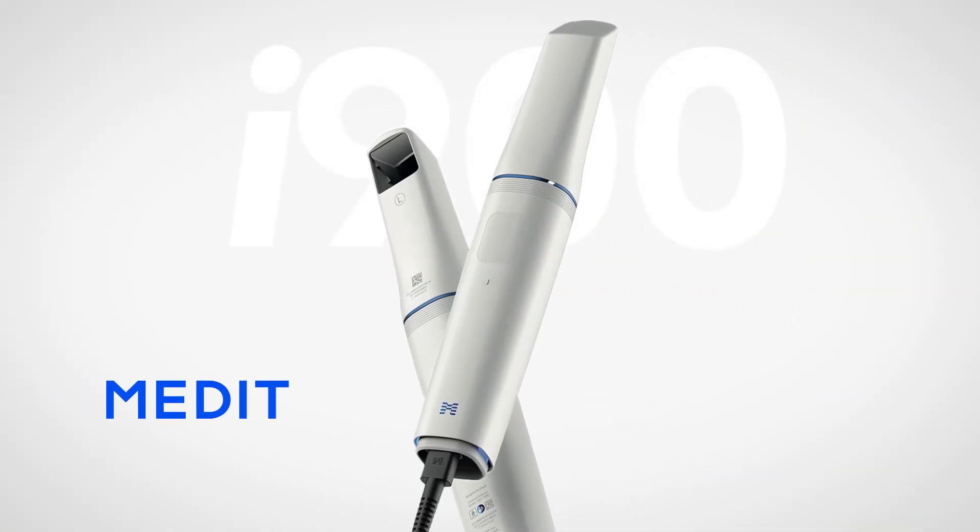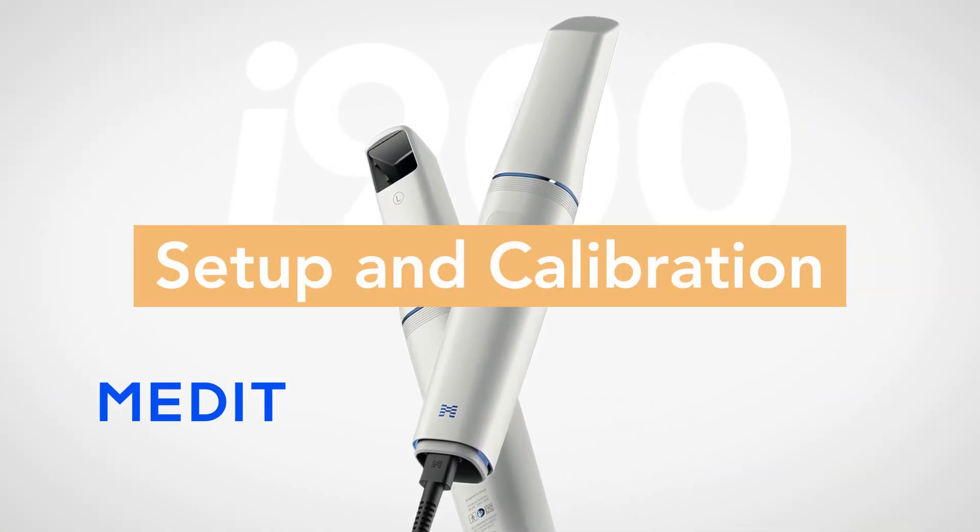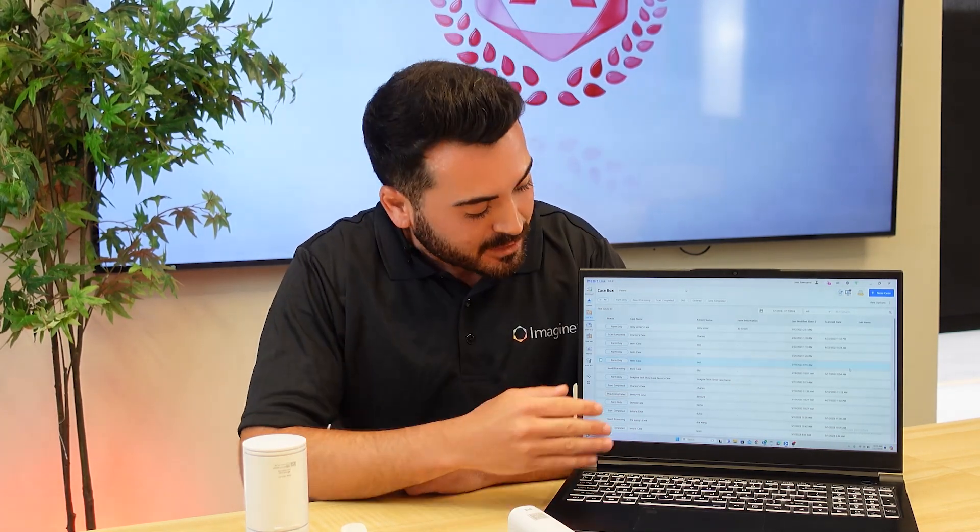Now that we've completed the full unboxing and review of all the components for the scanner, I want to demonstrate how to do your first setup and calibration for the i900. The first thing we want to do is make sure that we have our Medit Link and Medit Scan for Clinics software installed on our workstation. Remember that the Medit software is compatible with both Mac and PC computers. Once the software is installed, we are ready to connect our scanner.